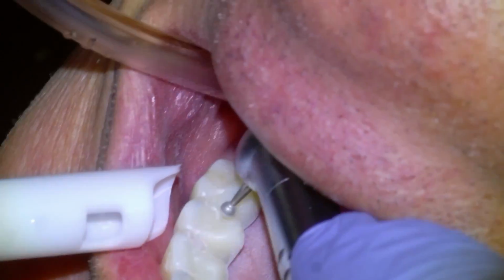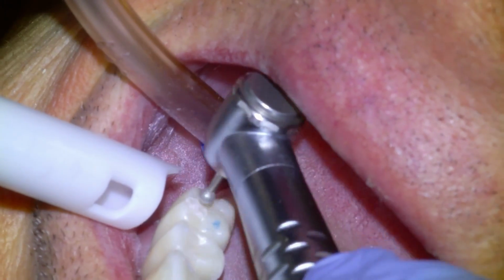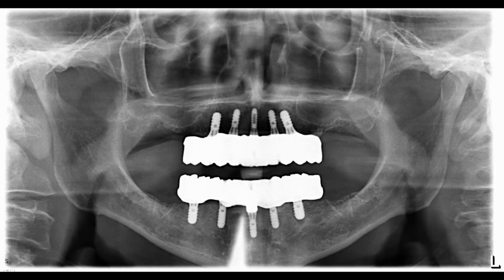Patient gets sent home. They're happy. They like these things. Takes a little bit of getting used to, of course, but they work. I've probably done about 14 of these things at this point, and they work great. There's an X-ray showing them in place, and then there's a photo showing the patient smiling.